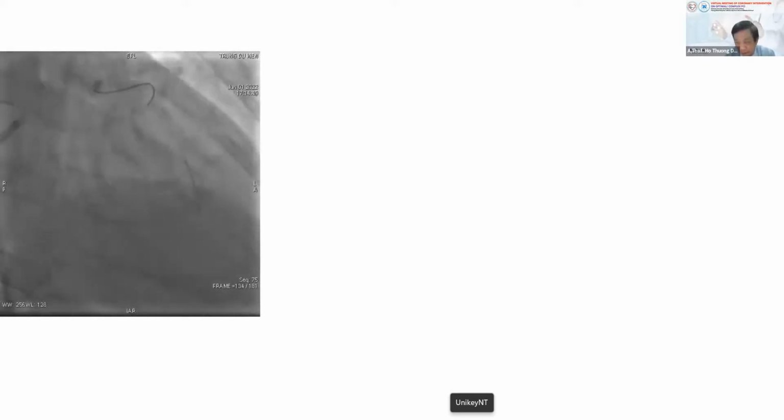But when I did it, we could not do it with the microcatheter, because the microcatheter cannot go through the very stenotic lesion in the curve. So I took the microcatheter to the lesion, and after that the RotaWire went directly distal. But the RotaWire could not go distal.